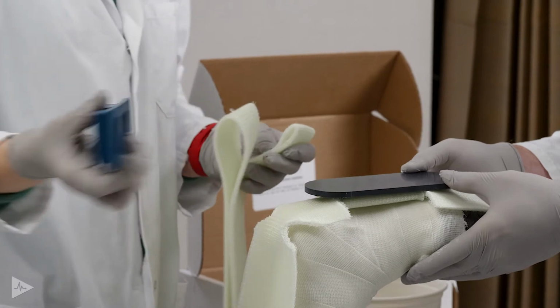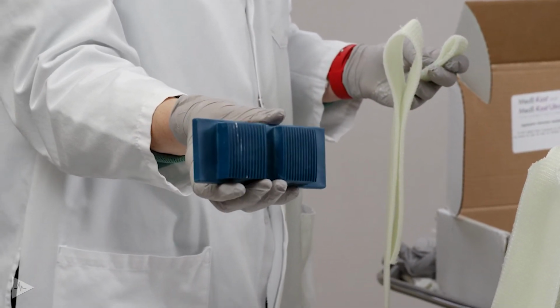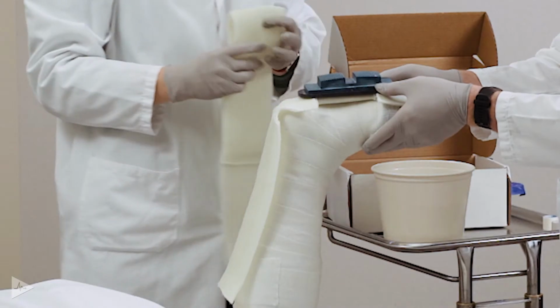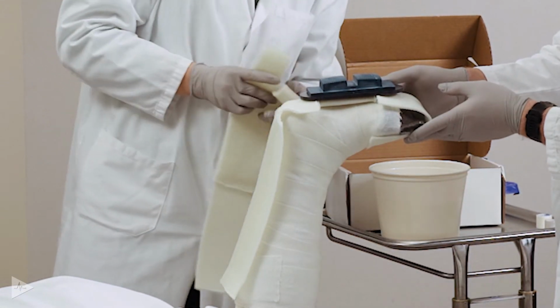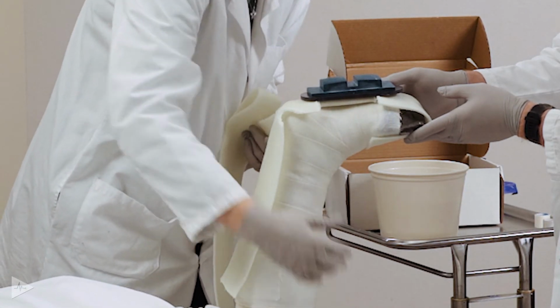And then we have the peg for support when taking any steps or transitioning, and that will lay over the top of the foot plate. The gap in the middle between the two peg pieces should be aligned with the anterior tibial crest. So we want to bring this down in a straight line to the tibial crest.